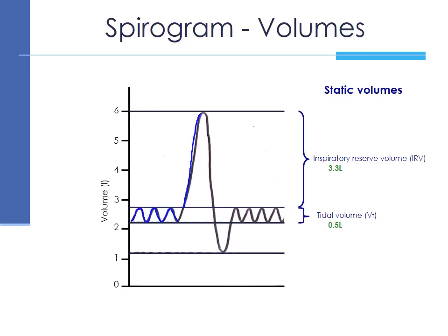Now, for the next part of the maneuver, the patient was instructed to exhale completely. So that would be after normal exhalation, the exhalation which takes place even further, and that represents the expiratory reserve volume. In other words, the reserve that you have to expire after a normal exhalation. And this volume is usually about 1 liter.